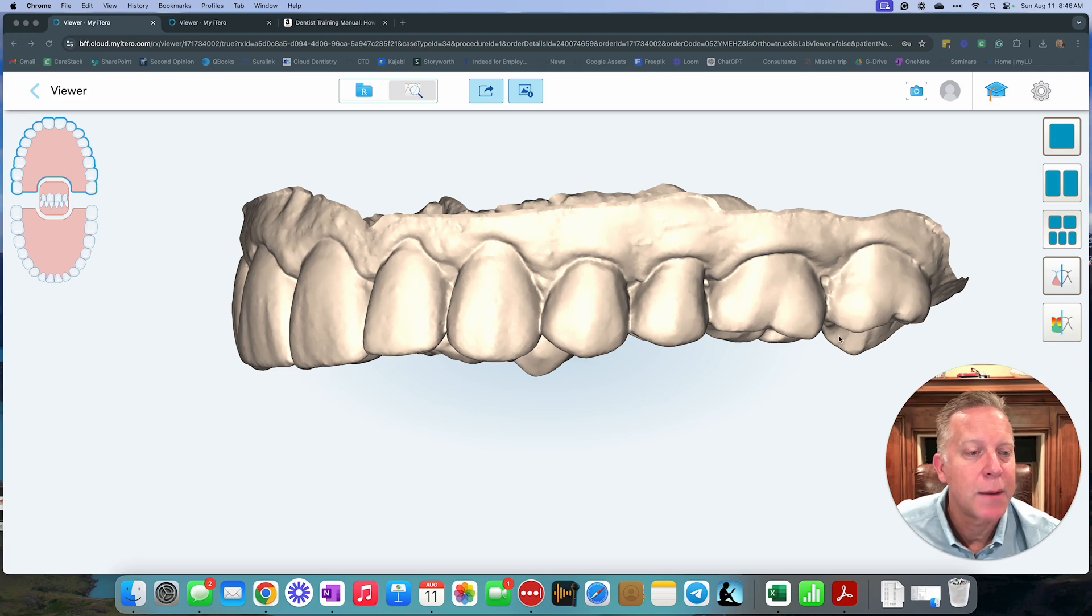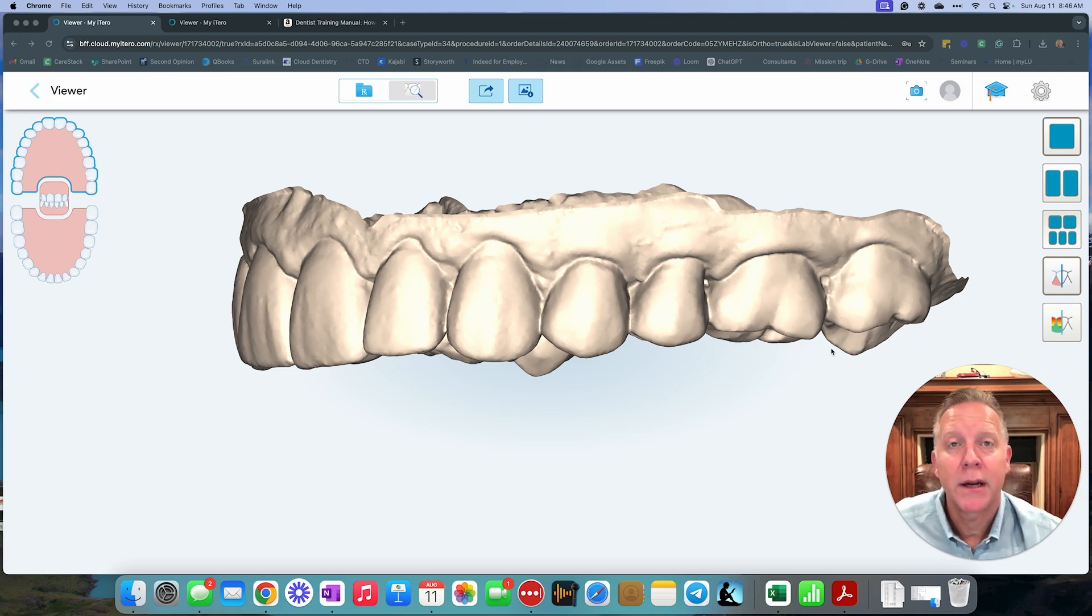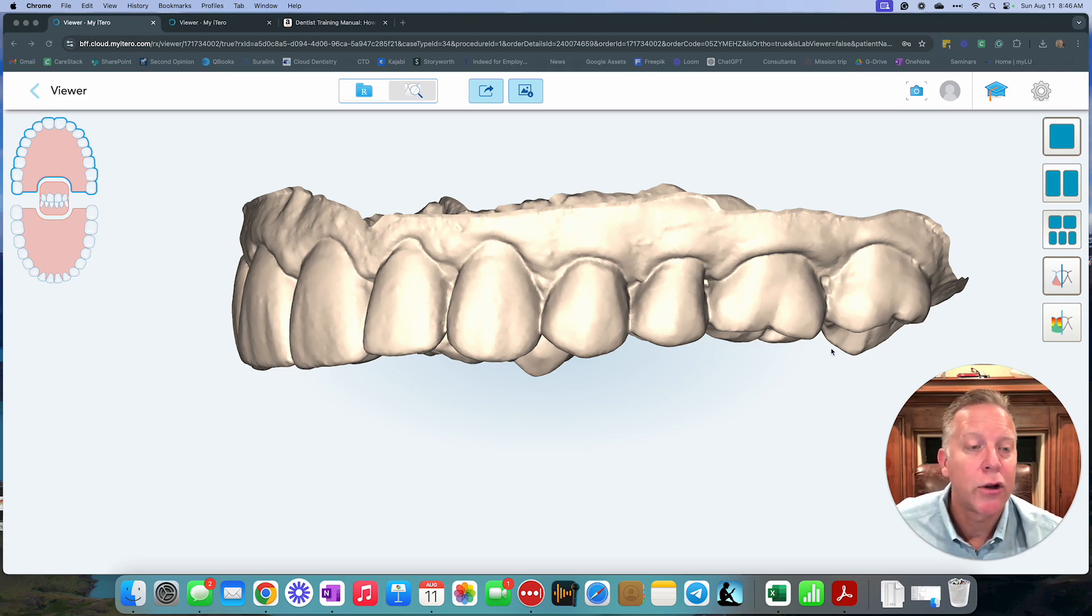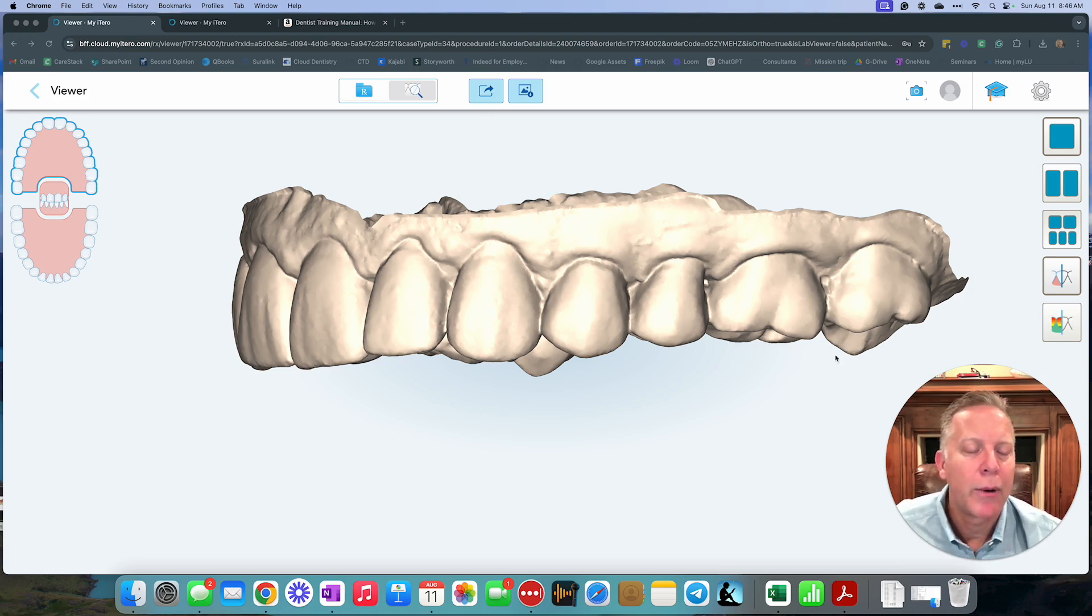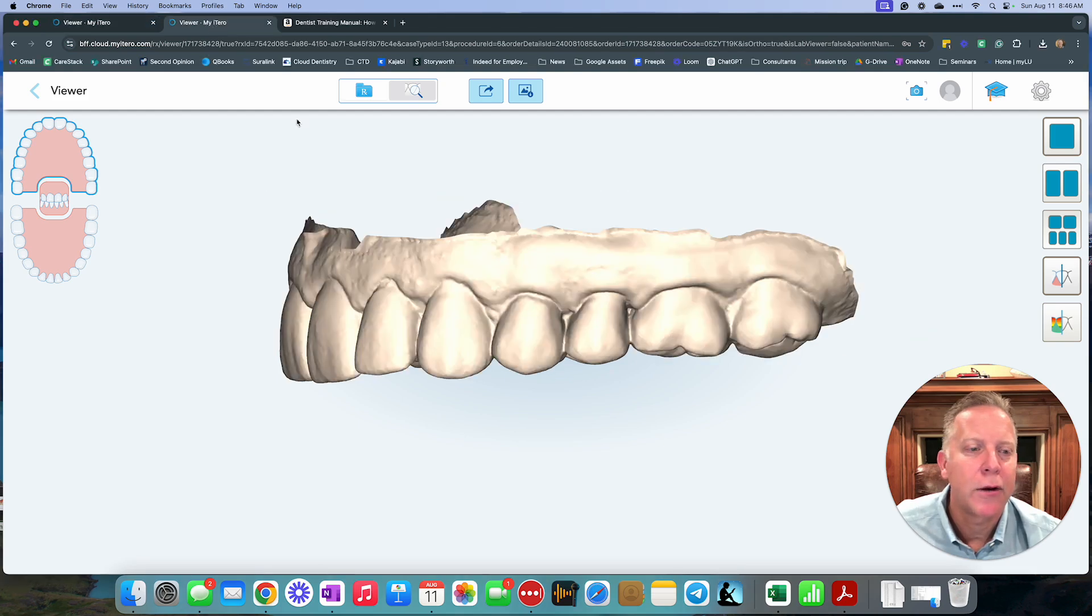So here you can see an example of a patient who, right before we did a night guard scan, I took a look at this and noticed that this cusp was hanging down more than it should. And so I went ahead and made a reduction. I'll show you that.